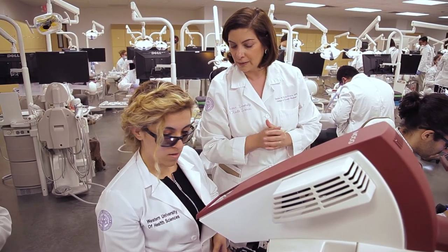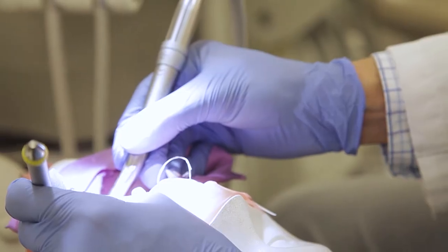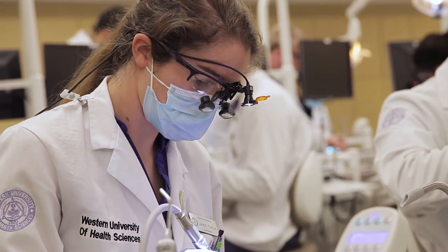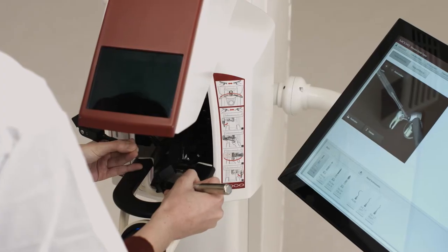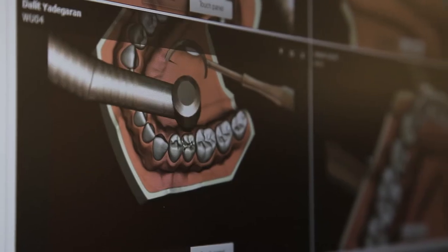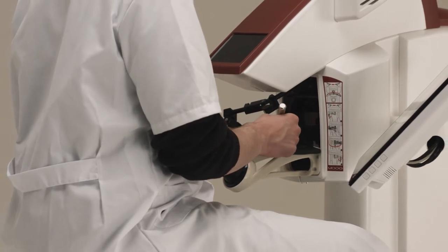When we work on the traditional mannequin heads with the plastic teeth, it's really just a solid piece of plastic with a screw in the middle. If you took your handpiece or a drill and went through the tooth, it just feels like plastic until you hit the screw, as opposed to a virtual reality experience. When you go through the different layers of the tooth, you actually feel the changes — that really mimics the clinical experience in a real person's mouth.